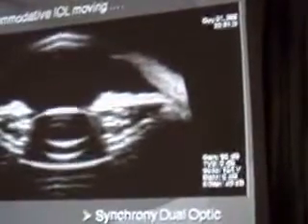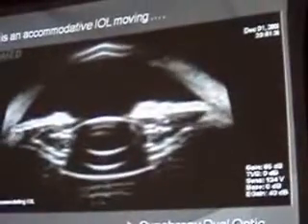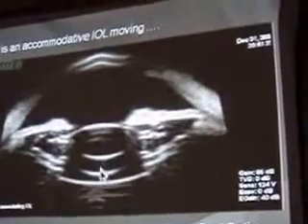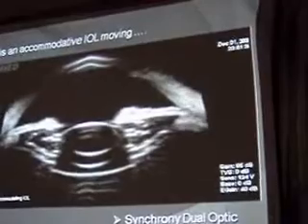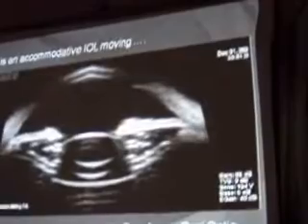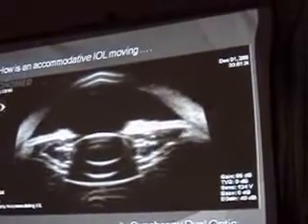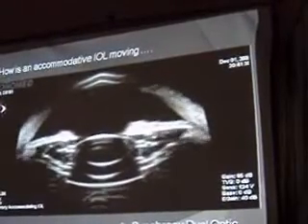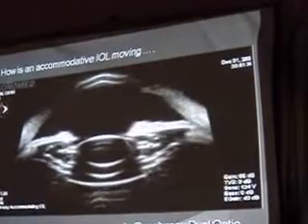Then, if you see, the lens is clearly moving and creating a larger space between the two lenses. It's coming in only one piece. You don't need to implant two lenses. It's only one piece and you implant one. The lens itself is two lenses, constructed or built as two lenses, which is a pretty impressive video clip showing clearly how an intraocular accommodative IOL moves exactly in the way that the manufacturer describes.